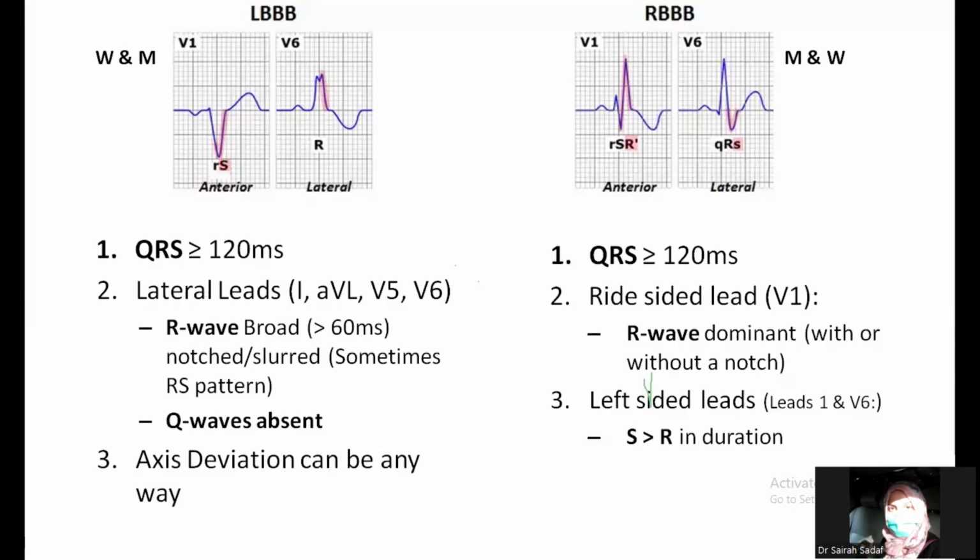Okay? Now let's look at the ECG again. The right-sided leads, V1, V2, there may be RSR pattern, RS capital R pattern, R small, capital S, capital R pattern.